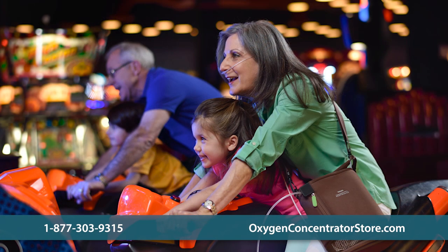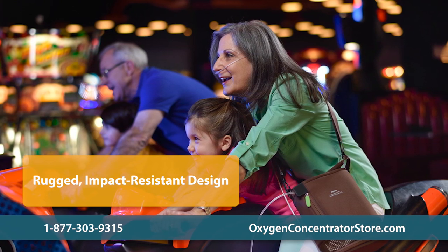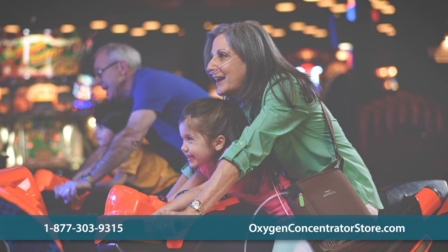While lightweight and easy to carry, the Simply Go Mini has undergone rigorous testing to ensure that it can withstand extreme vibrations, temperatures, and impacts. The unit is perfect for active users.